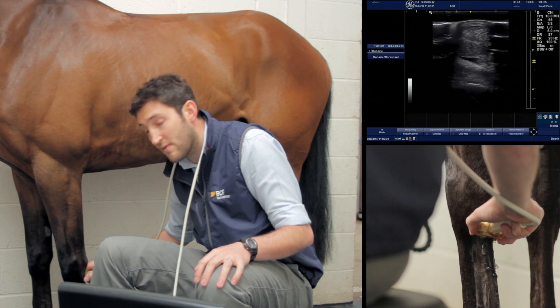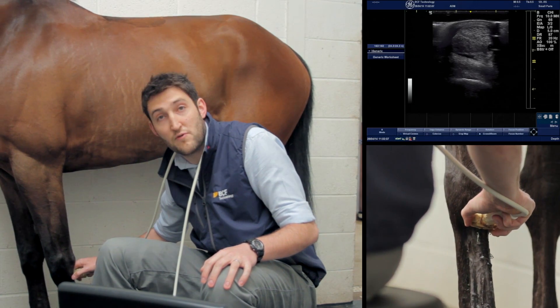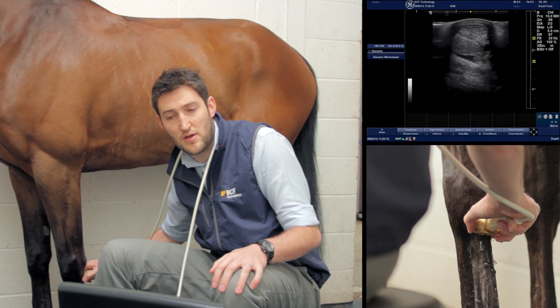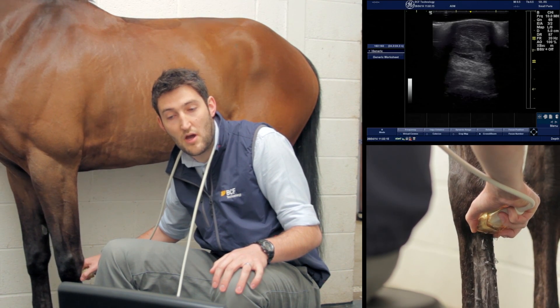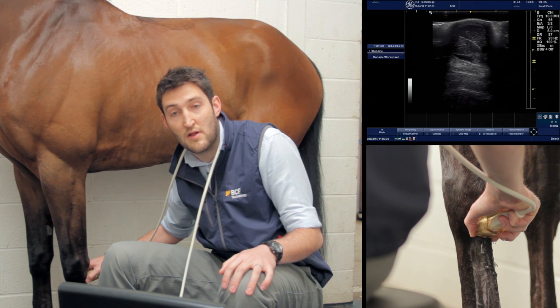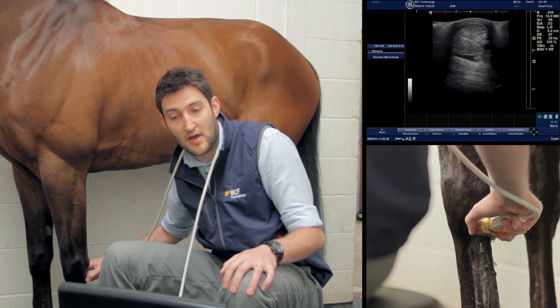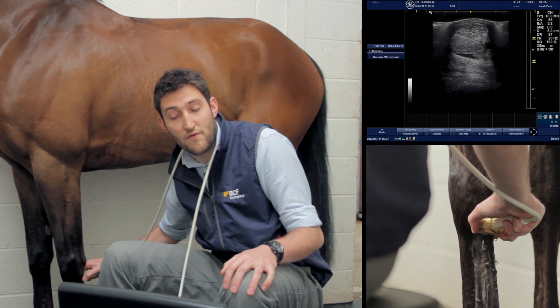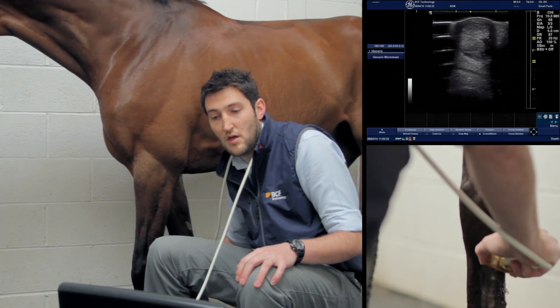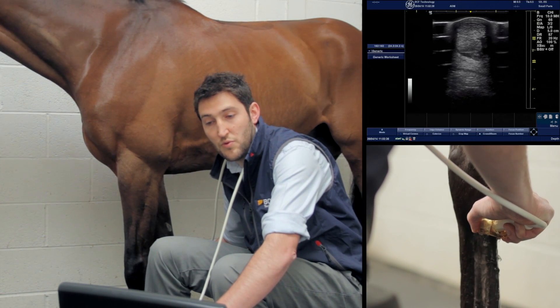We're in position 1a, about three or four centimeters below the accessory carpal bone with the image on screen. If I tilt the probe up, we lose the image of our superficial and deep flexor tendons. If I drop the probe down, we lose everything. We're aiming to get the best image possible of all the structures.